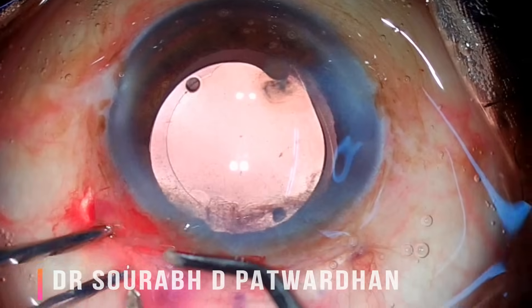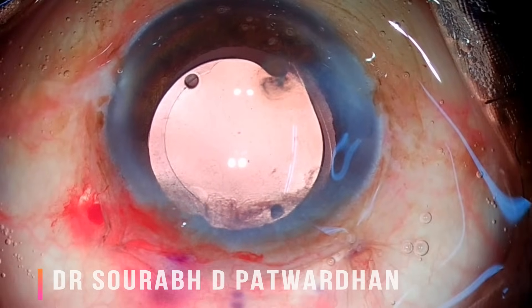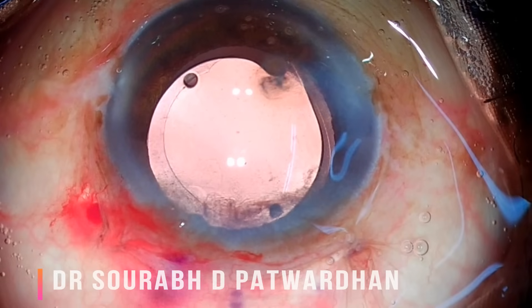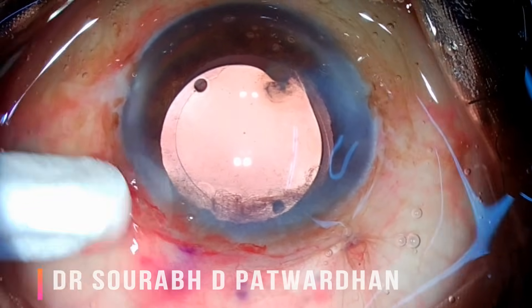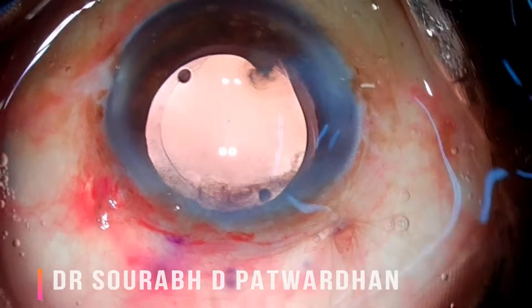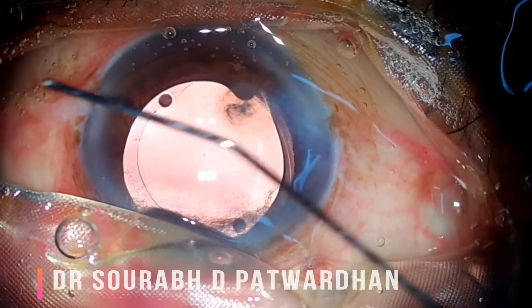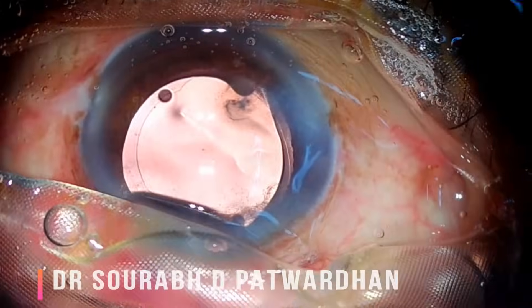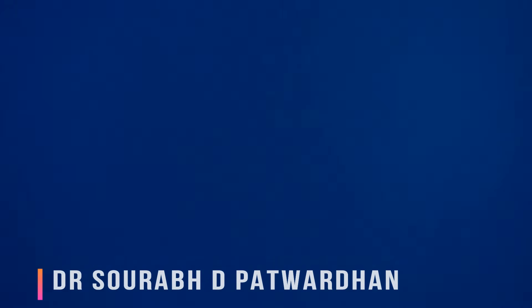Just a little bipolar cautery to close the conjunctiva — no sutures are needed. This is small incision cataract surgery. Watch each and every step very carefully; I have explained the most important thinking process behind each step. Have great results with this very nice surgical technique for cataract removal. Thank you so much.